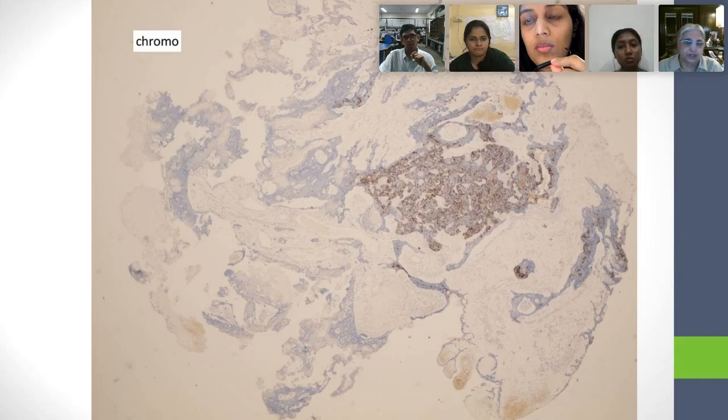Anybody wants to change their diagnoses now? Anybody? Ashish, you want to change your diagnosis? What about you? No. What about you, Kshitija? No. So why do we have synaptophysin and chromogranin? What does synaptophysin and chromogranin mean? Neuroendocrine differentiation. So why are we seeing this here?